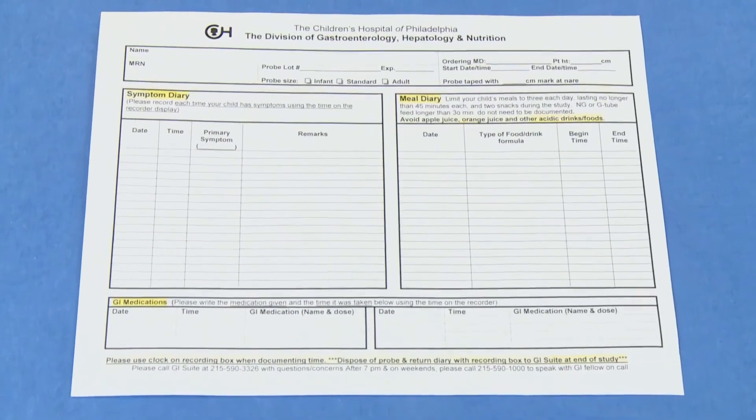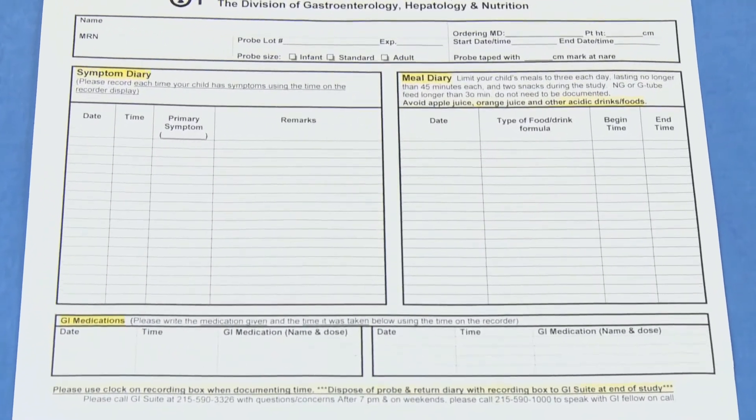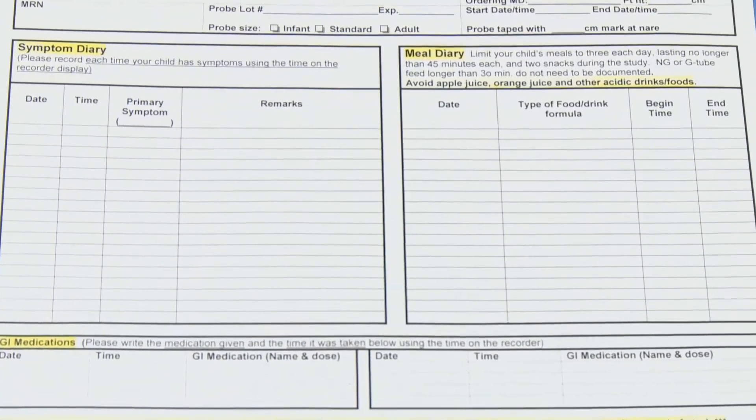An x-ray will be done to confirm the location of the impedance pH probe in your child's esophagus. Sometimes we may have to adjust the placement of the probe a few centimeters after the x-ray. Once correct placement has been confirmed, the 24-hour study begins. The probe is connected to a recording device that will display your child's name, date, and time. You will use the time on this device when filling out your child's diary.